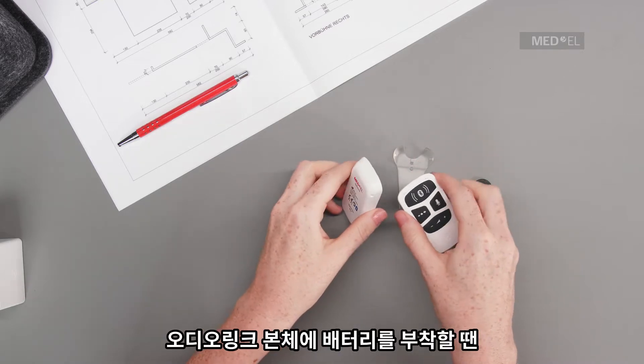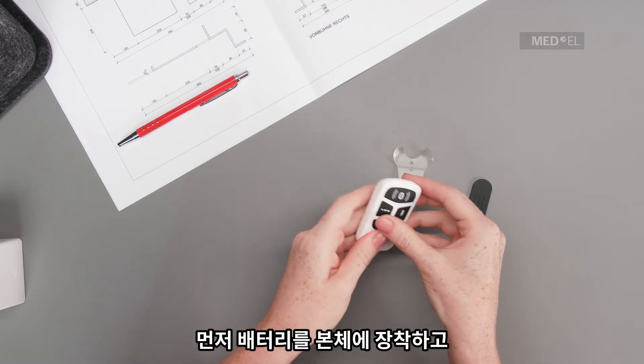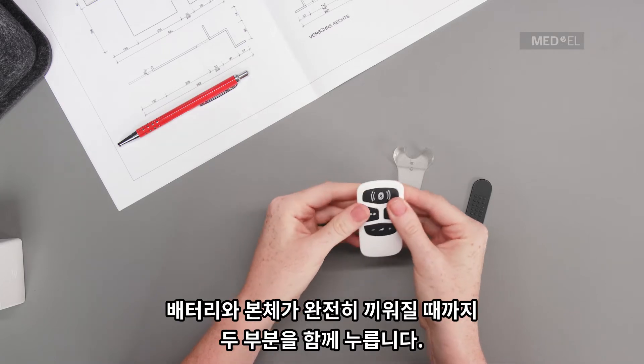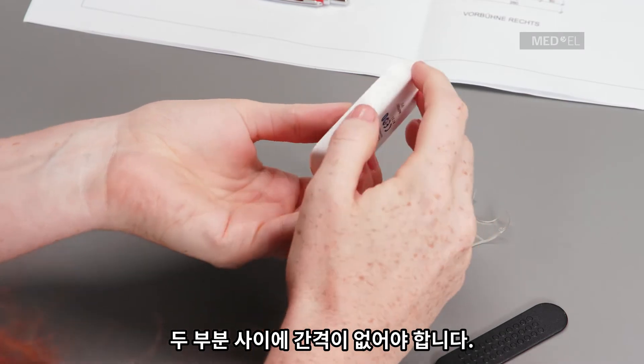To assemble AudioLink, first attach the battery unit and the main unit starting at the bottom. Press the two parts together until the battery unit fully snaps into the main unit. There should be no gap between the two parts.